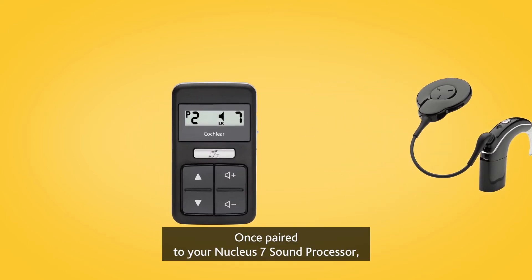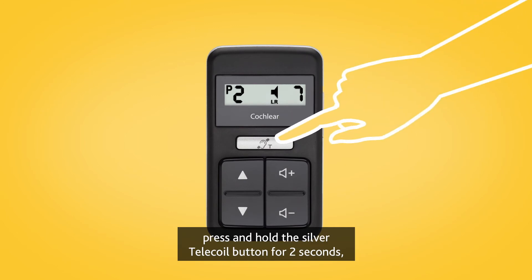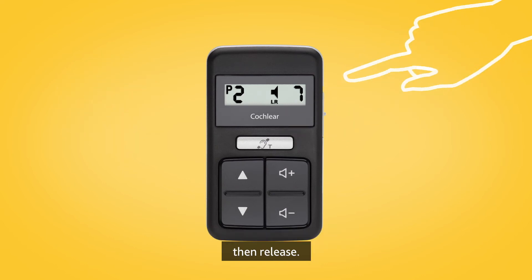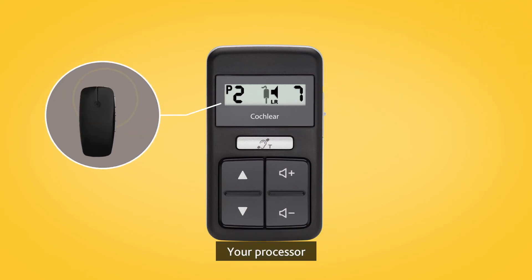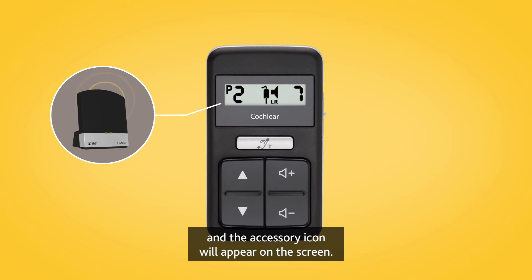Once paired to your Nucleus 7 sound processor, press and hold the silver telecoil button for two seconds, then release. Your processor will start streaming from your mini microphone or TV streamer and the accessory icon will appear on the screen.